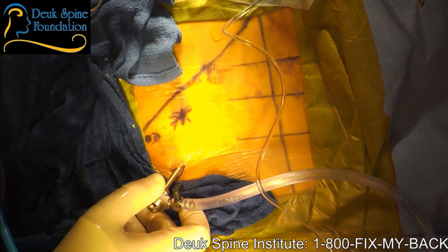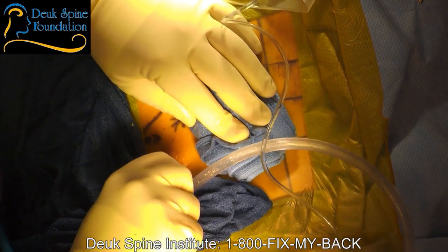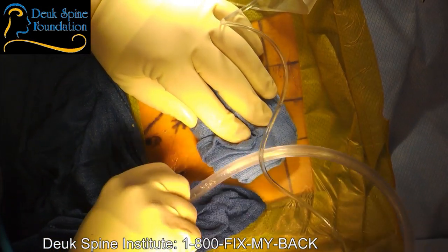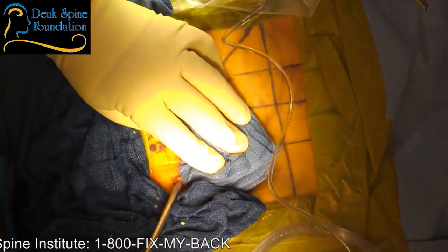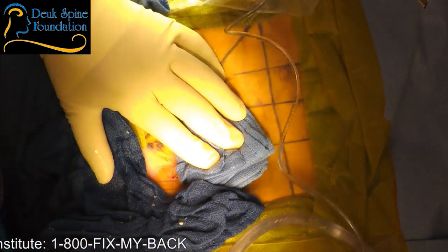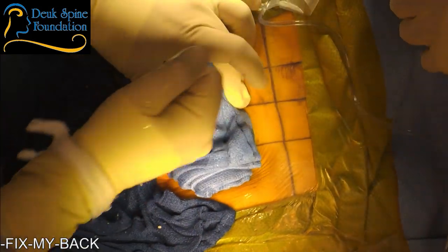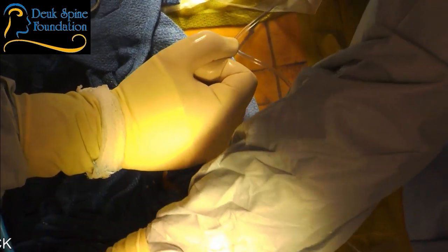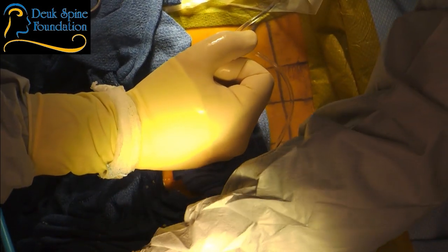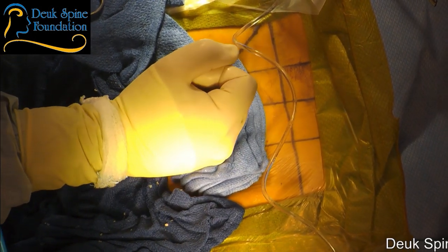All right, let me have a blue towel. Sounds like he's sleeping and snoring nicely, blissfully. I think we lost 3 drops of blood, maybe 5. So we really didn't lose much blood. These surgeries are pretty much bloodless. I would say total we lost probably 3 cc's max. Go ahead and put some pressure.